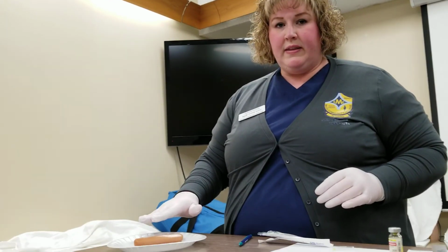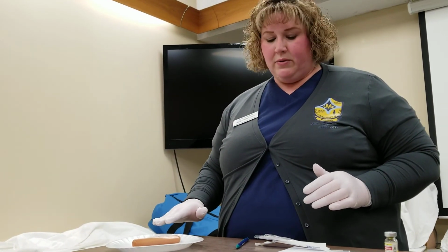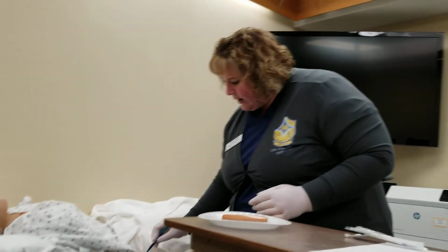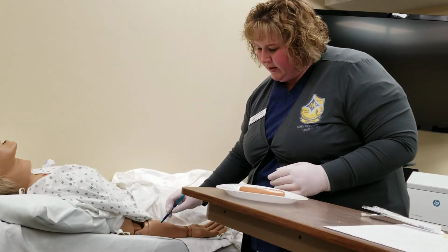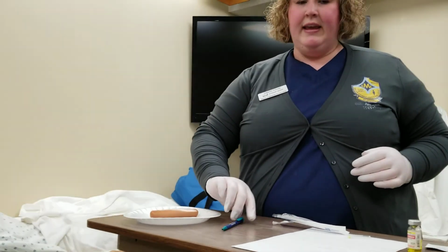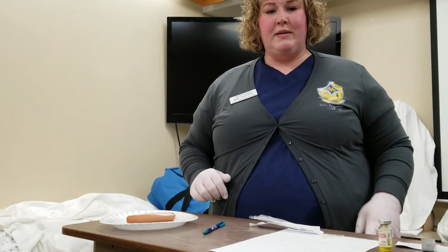Now, if there is anything on the surface, we can blot that, but we are going to be careful not to rub it or apply a bandage. And then we are going to draw a 1-inch circle around the area so that it can be rechecked. And then we are going to make sure that it gets documented correctly.